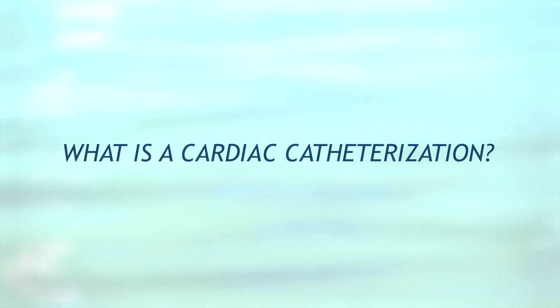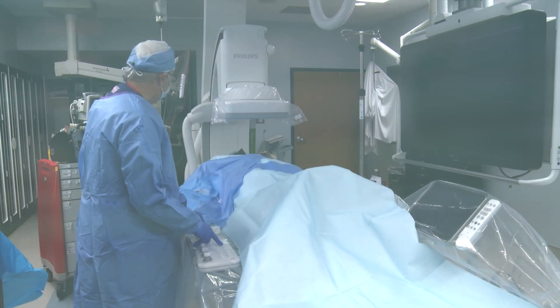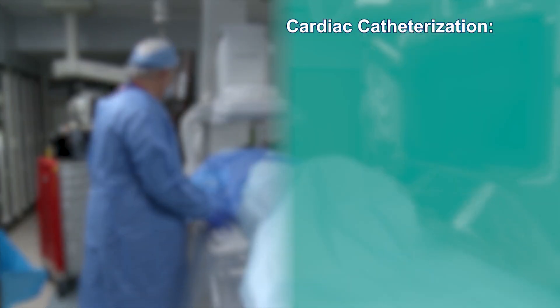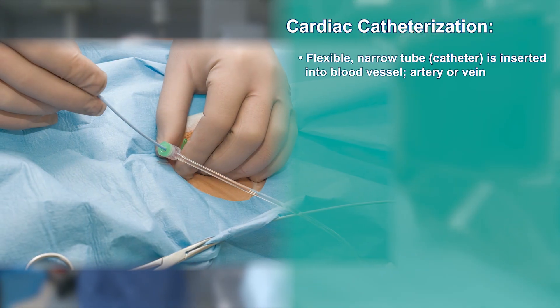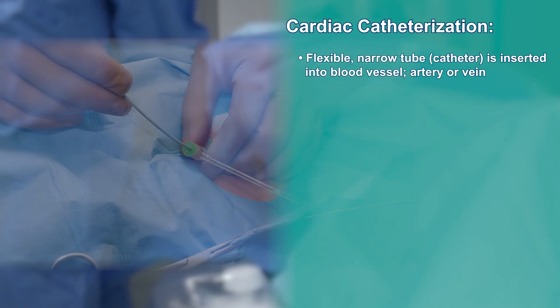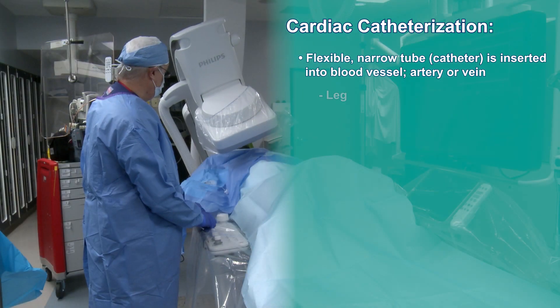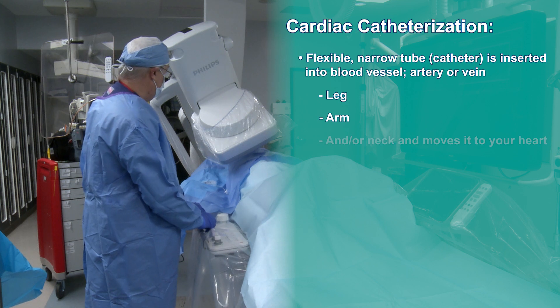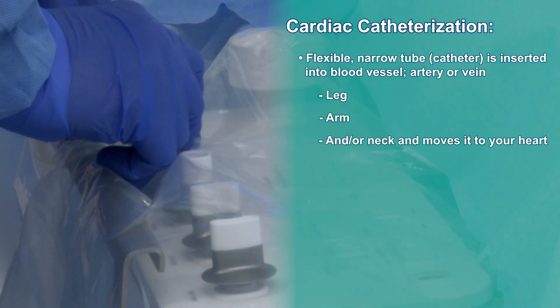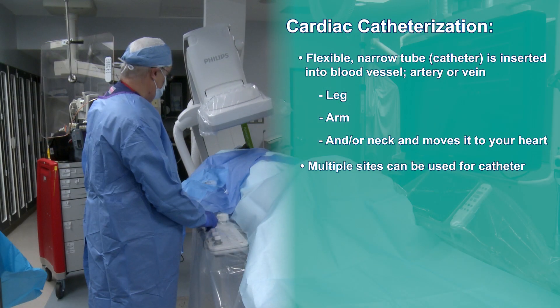What is a cardiac catheterization? During a cardiac catheterization, a cardiologist puts a flexible narrow tube — a catheter — into a blood vessel, an artery or vein, in your leg, arm, and/or neck, and moves it to your heart. There are multiple sites that can be used to insert the catheter.